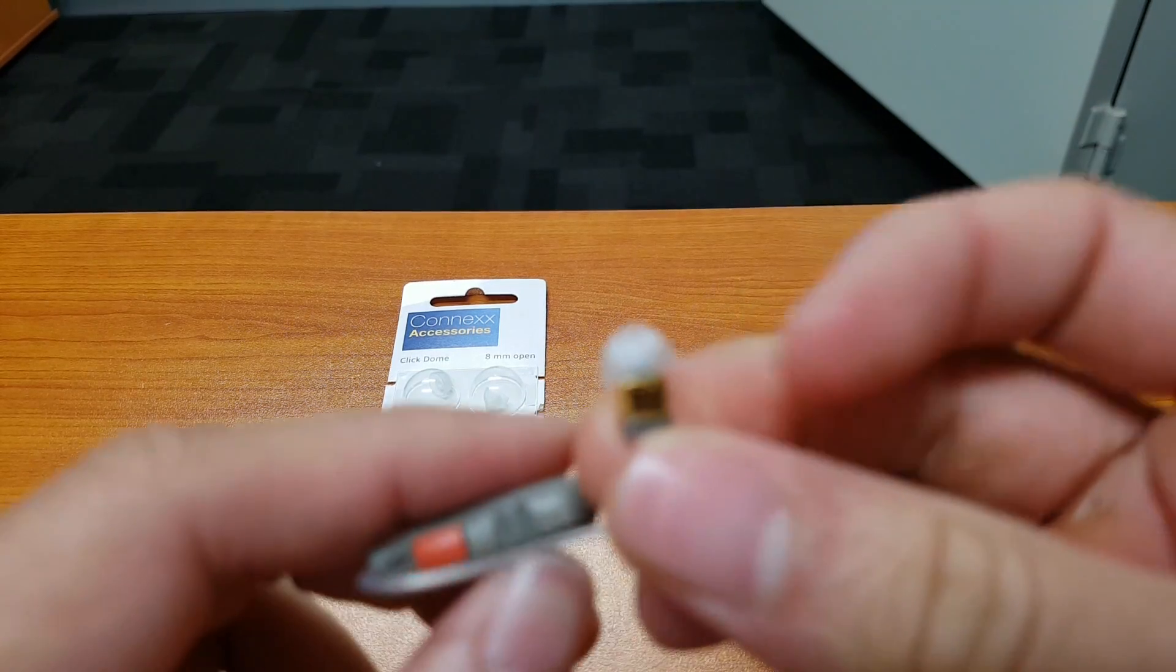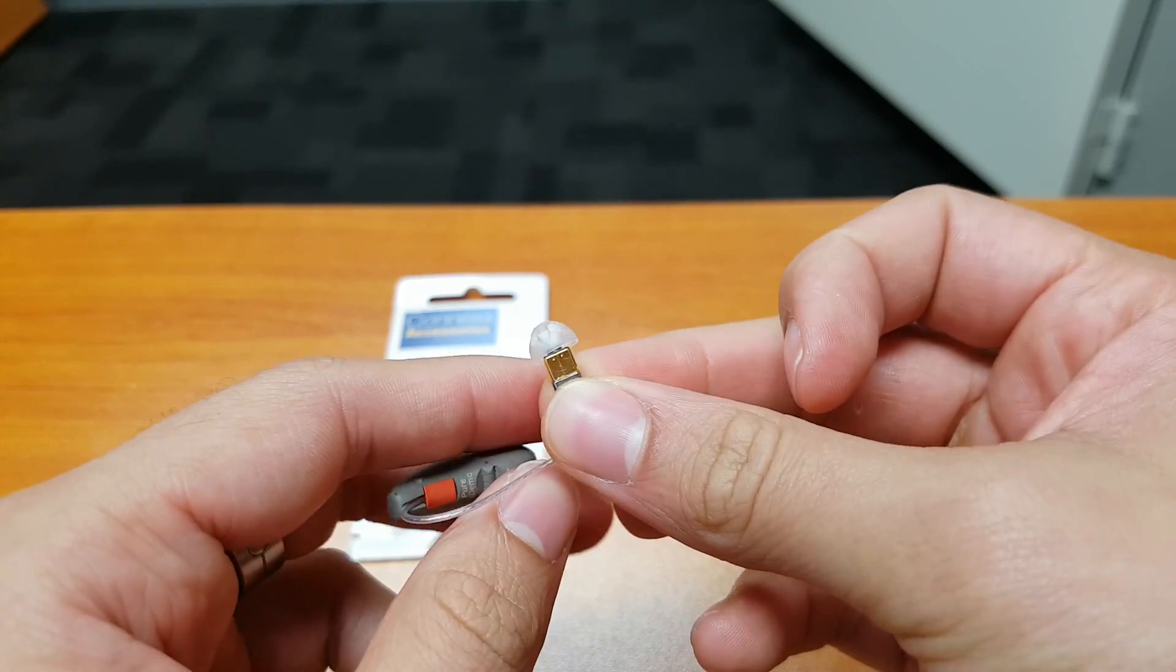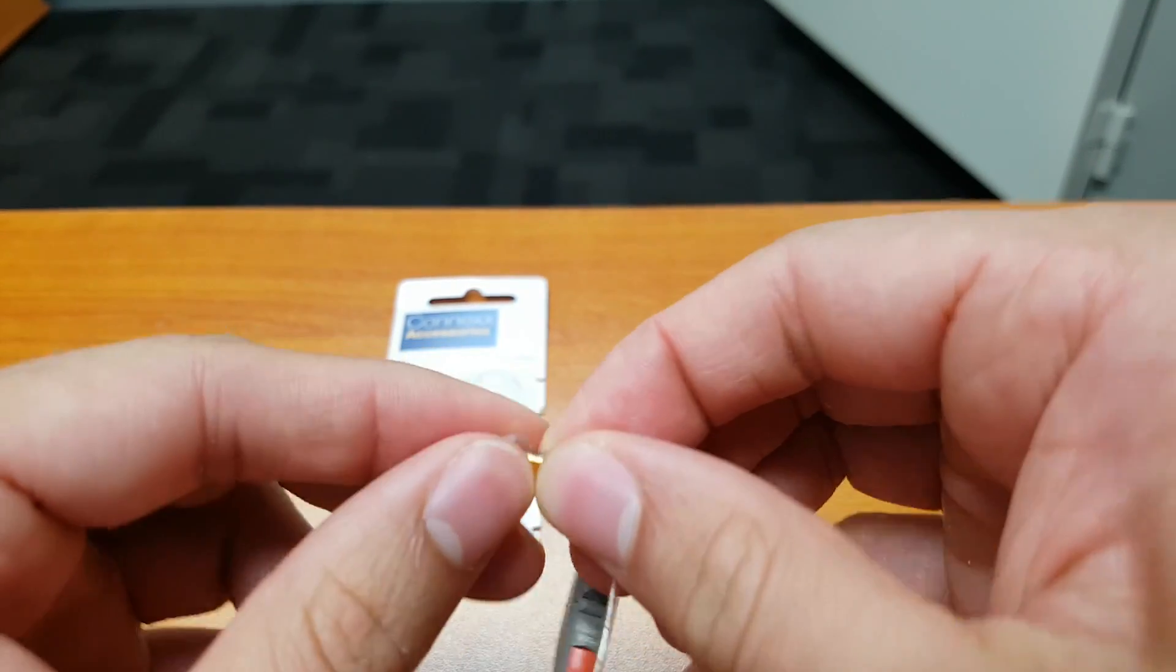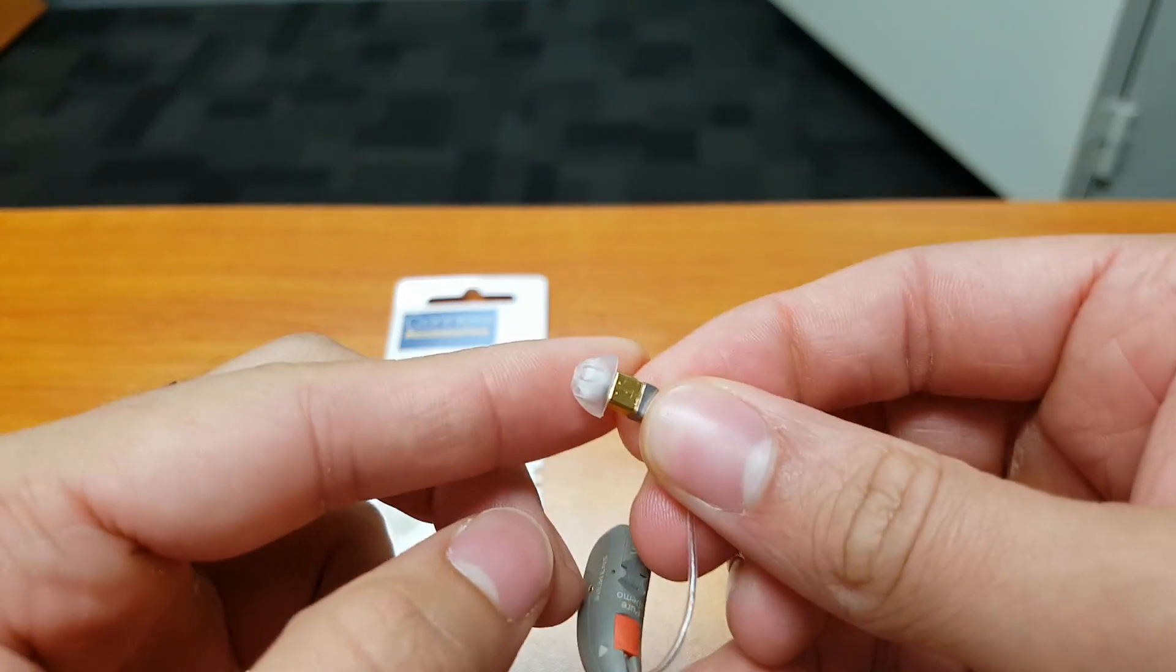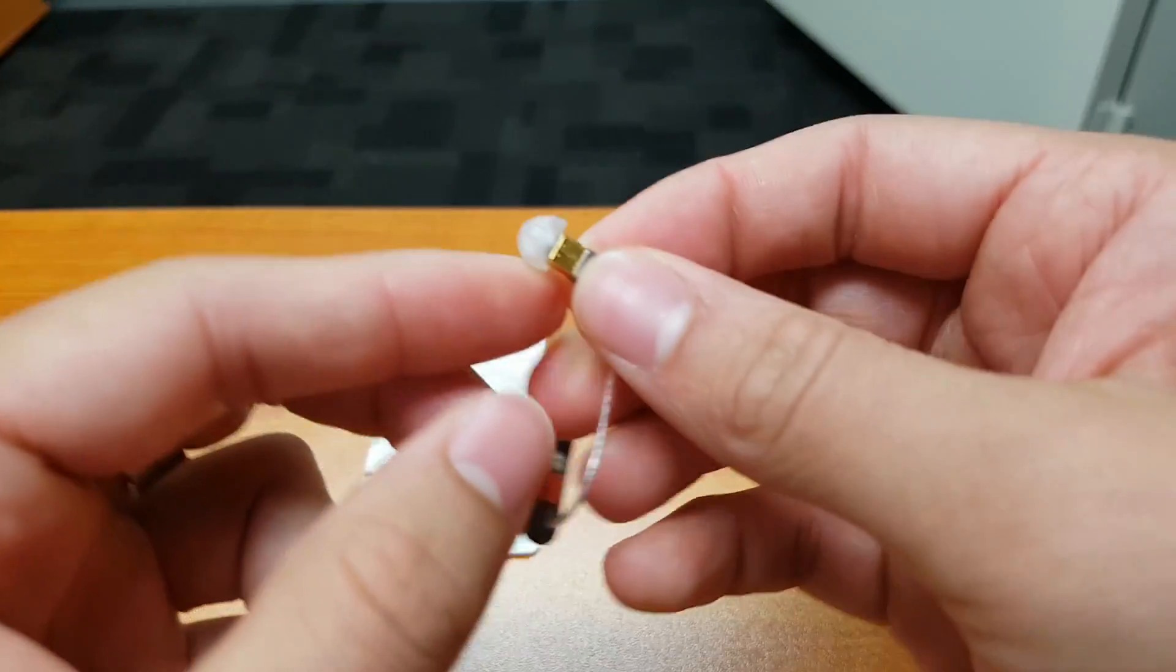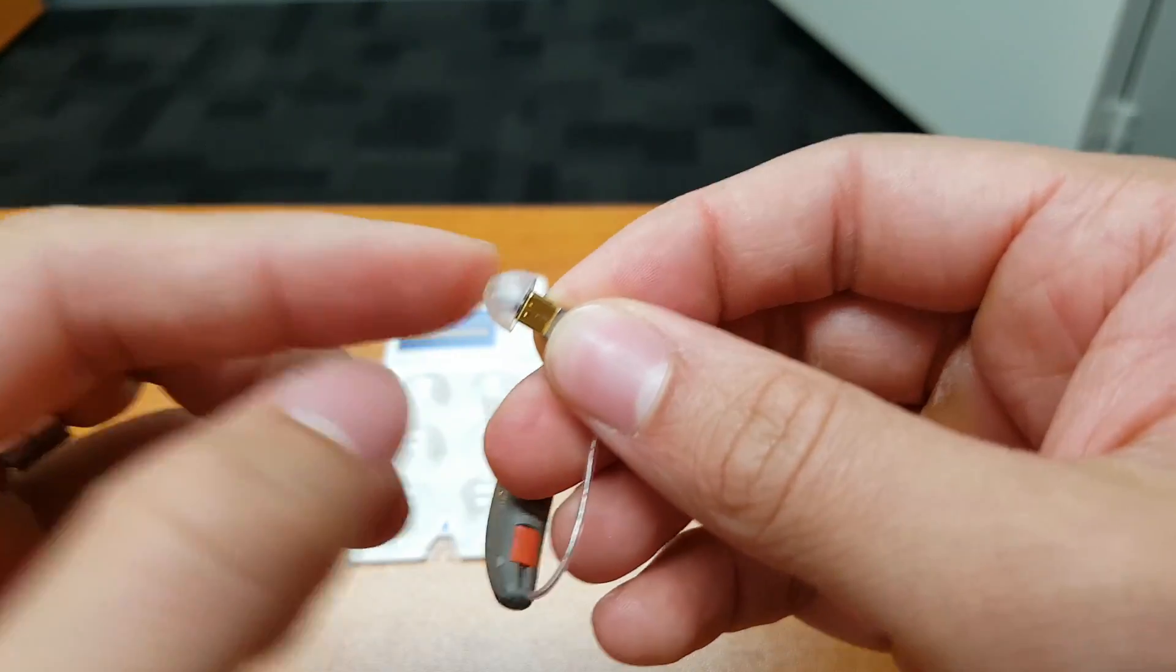So if we have a closer look at the dome, it's quite a firm fit. If I give that a bit of a pull, that dome is not going anywhere. What happens is that rubber dome clicks into place.